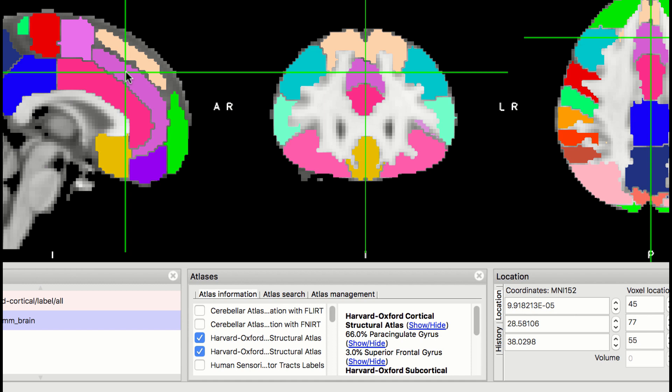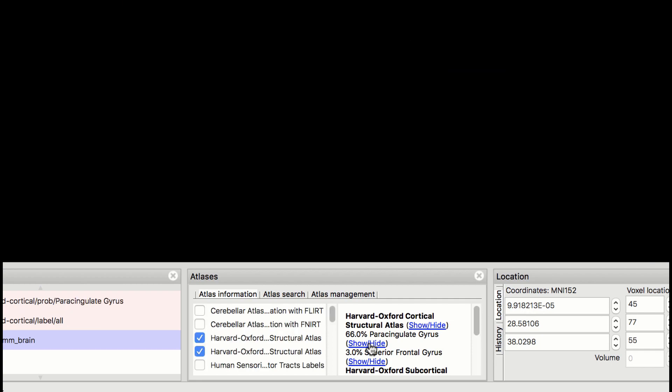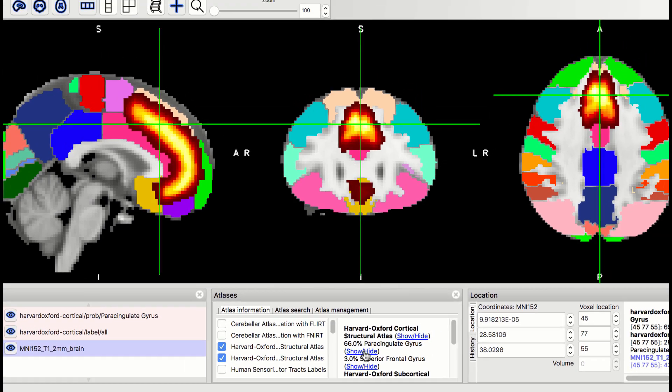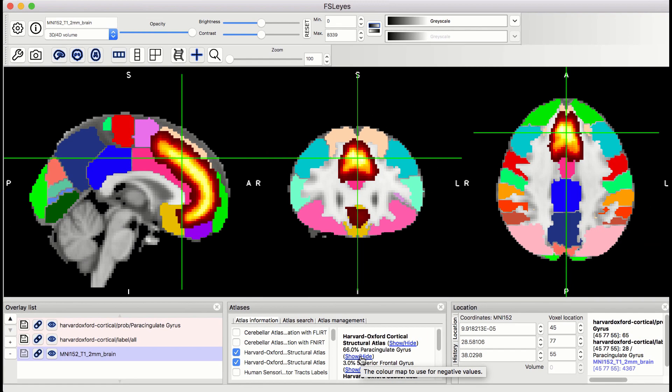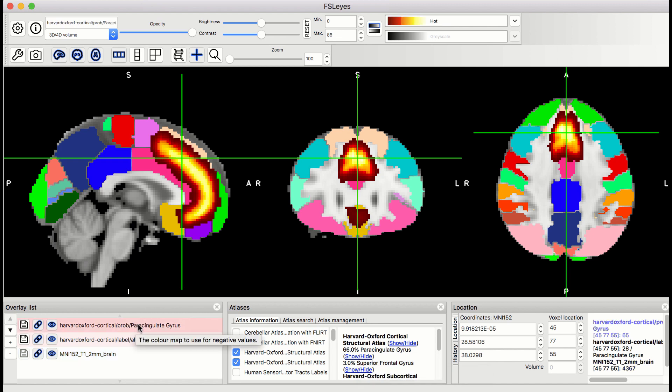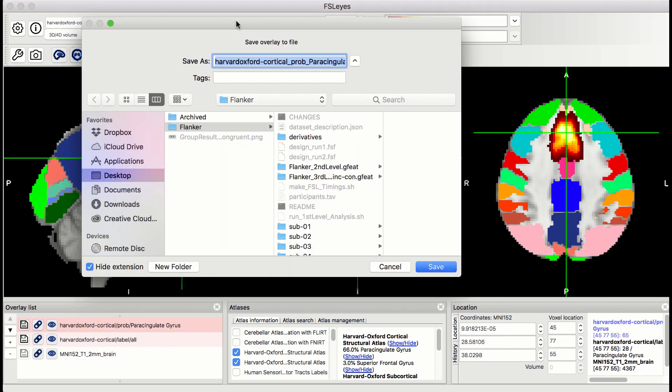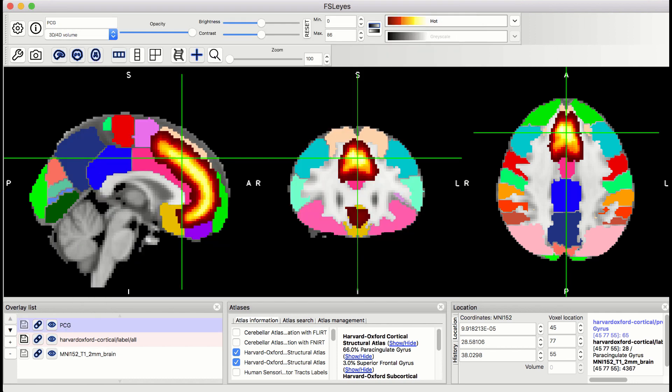To save one of these regions as a mask, click on the Show-Hide link next to the region you want. In our example, let's say we want to use the paracingulate gyrus. Clicking on the link will show that region overlaid on the brain, as well as load it as an overlay in the Overlay List window. Click on the disk icon next to the image to save it as a mask. Save it to the Flanker directory and call it PCG.